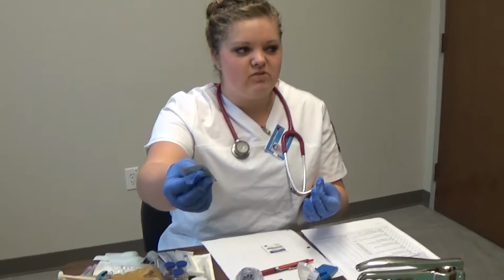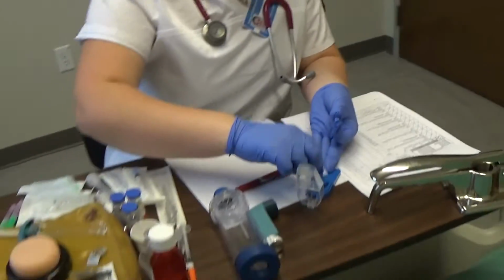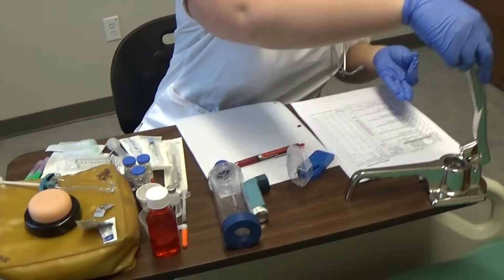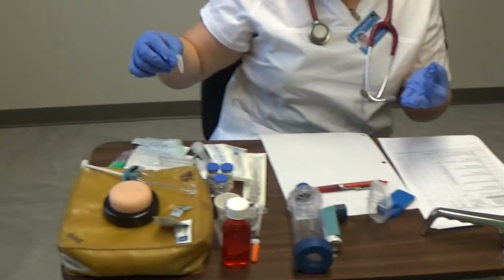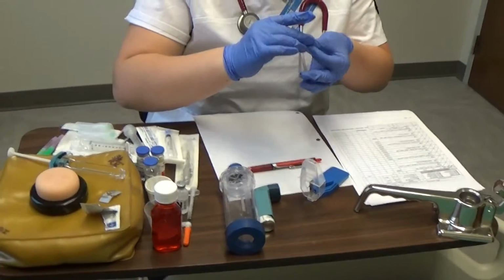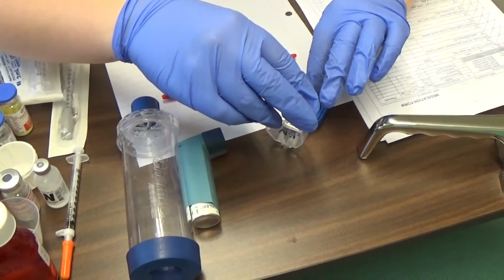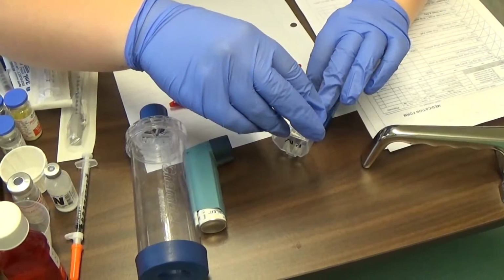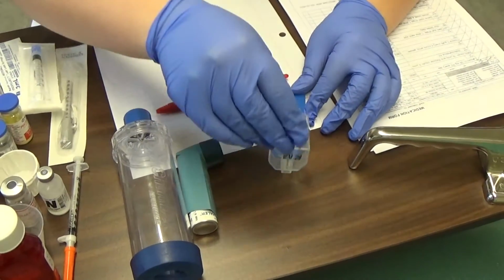I'm going to have my assistant open this for me real fast. So I'm just going to do a quick clean out here just so we can make sure that we don't get any extra medications or contamination. And then just do a wipe through here just to make sure that it's clean, and then this will go into the trash. Alright, so I'm going to place this in here, and I'm going to try and line up all the score marks correctly. There we go.